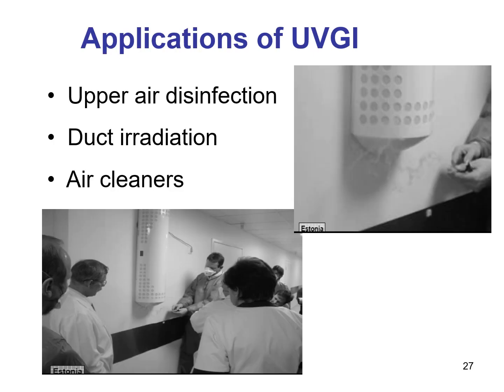We are talking about upper air disinfection. UVGI can also be used in ventilation ducts. This picture shows another application. A UVGI air cleaner is being tested in the multi-drug resistant tuberculosis reference center.